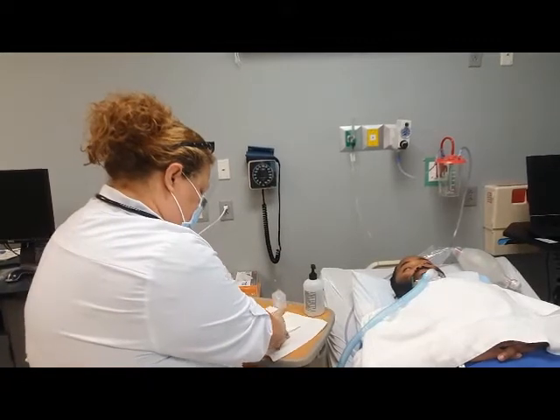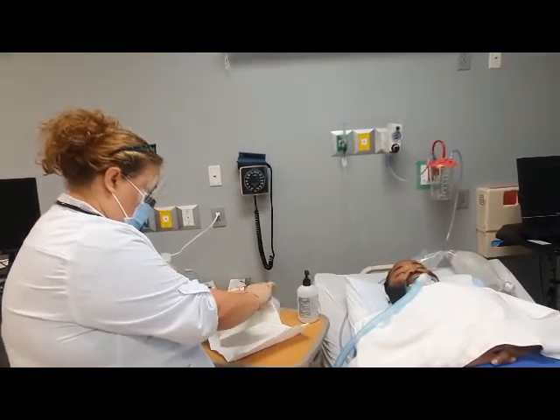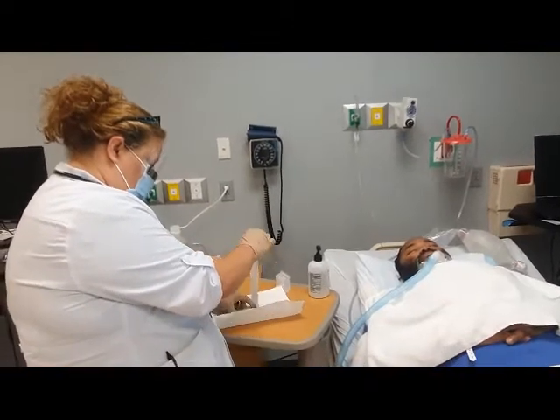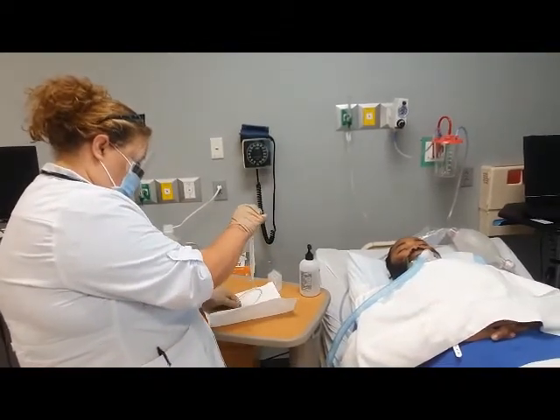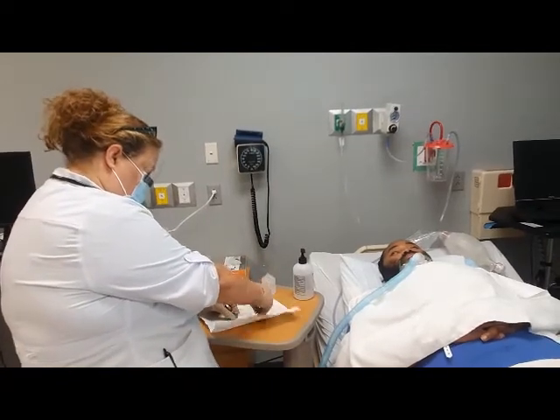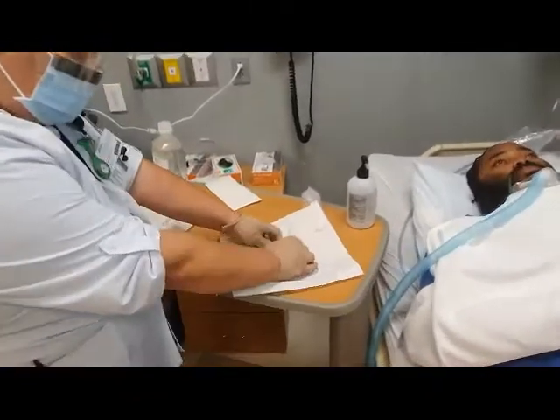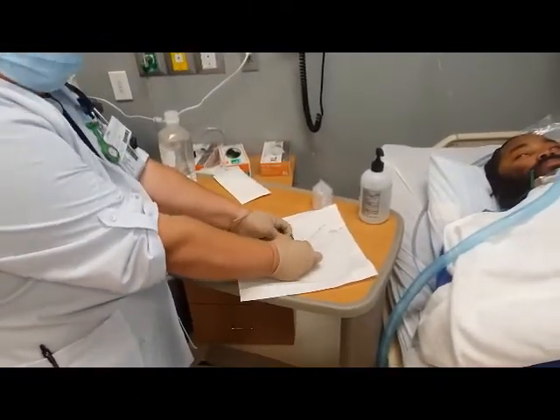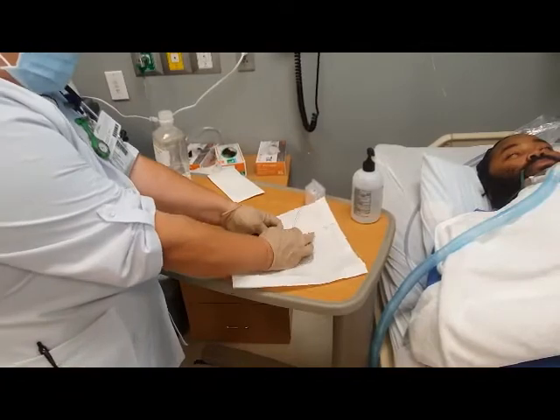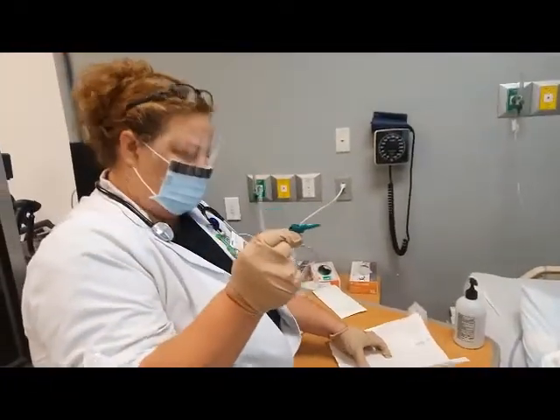You have to get into the kit. Hold suction tubing with the non-dominant hand, which will no longer be sterile, and you will connect the suction catheter to suction tubing, maintaining sterility of that dominant hand. So while you have it here, you can curl it the way you need to. Okay, do you see how I took my hands and I just curled it while it was in here on the sterile paper? You have it here, and you are ready to hold this piece right here to connect.